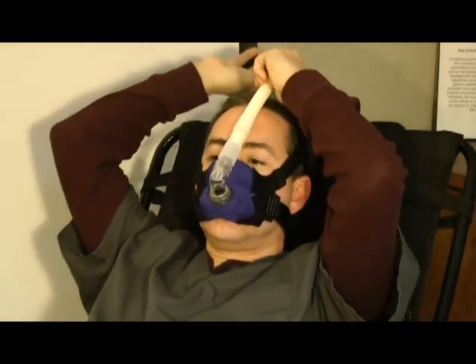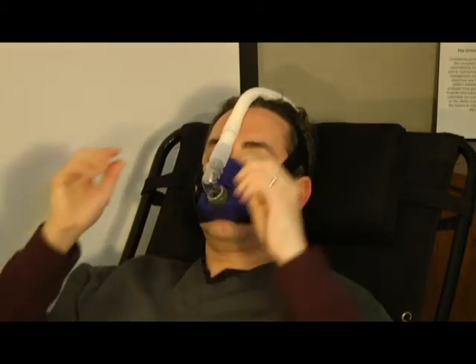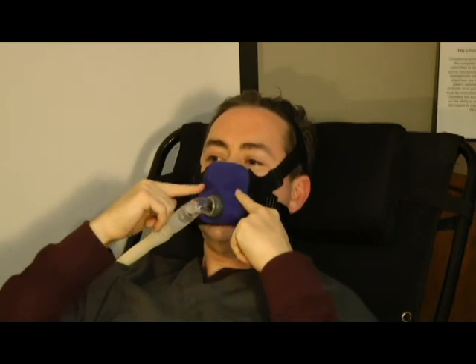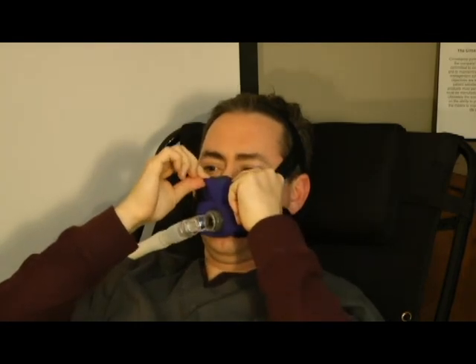Problems and solutions. There are a couple of common problems and solutions for this particular mask. Pressure on the upper lip can be alleviated by loosening the upper straps. Leaking can be alleviated by ensuring that straps are left and right equal and appropriately attached. The rest of the fit is through adjustment of the mask itself. If you are still experiencing a leak, pull the mask outward from your face and let it re-inflate, then rest the mask back on your face.